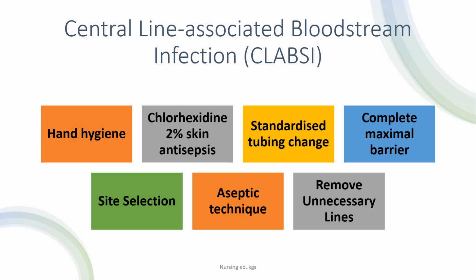Site selection is also an important factor because there are certain sites that are associated with higher infection rates than others, for example, the femoral site. Using aseptic technique for accesses and changing needleless connections.